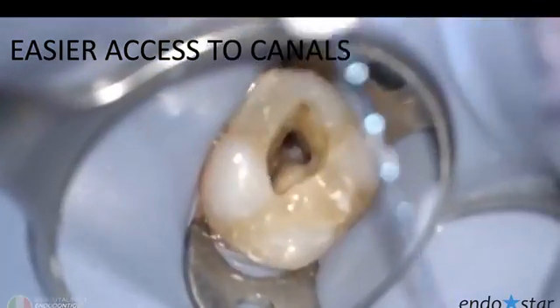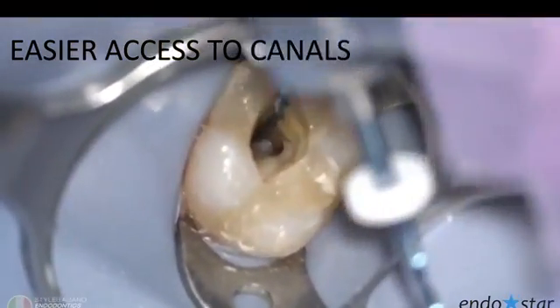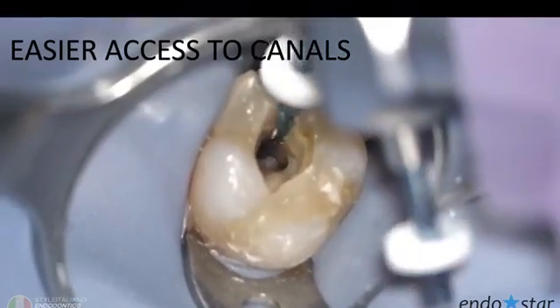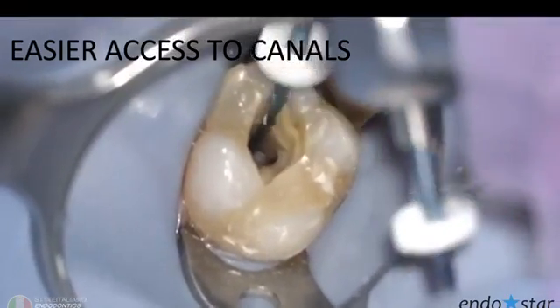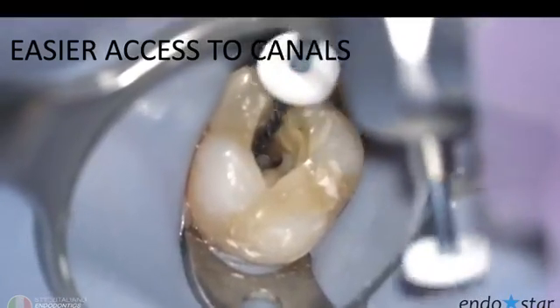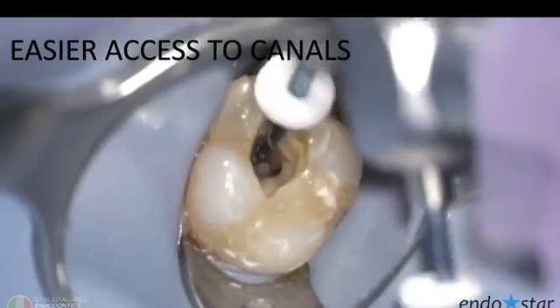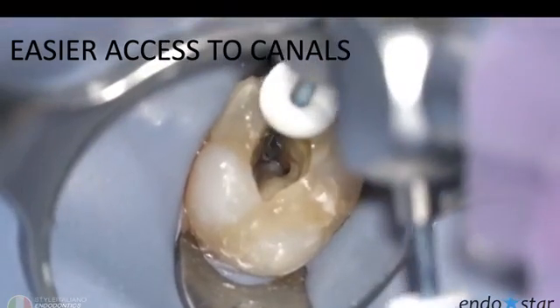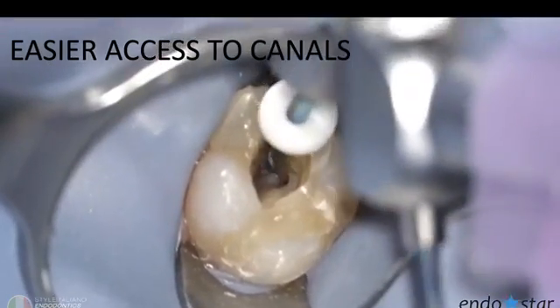Look, here I pre-bend the instrument so I can have easy access in this canal. As you can see in the video, I don't know if the video is working. You can have an easy access inside the canal because we can go inside it very easily. It's an upper 7.